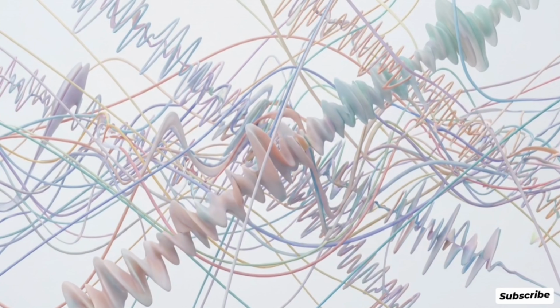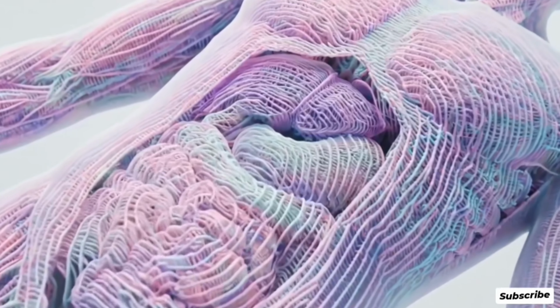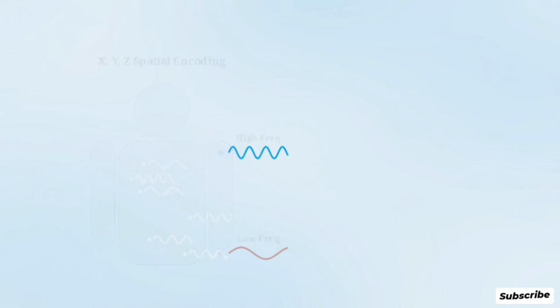But listening to the echoes introduces a massive logistical problem. With billions of signals firing simultaneously, how does the machine know exactly where in the body a specific echo came from? Gradient magnetic fields solve this. Coils divide the magnetic field into strict X, Y, and Z axes, building a 3D grid across the patient. Altering the field's strength forces protons in a shoulder to emit distinctly different waves than those in an elbow.